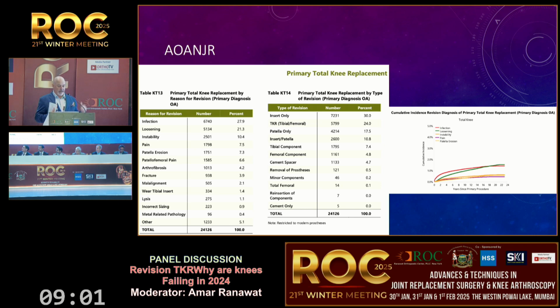Yeah, but there are some very good polys out there, right? And I think Dave made the point yesterday that most of the time when we make changes to our poly, we make mistakes. Right now, the highly cross-linked poly in the hip is fantastic, and it's only getting better. But now we're adding vitamin E, and lots of companies aren't giving you the choice. You just have to use it. So in the hip and in the knee, we'll see if vitamin E really is an added benefit or just an extra cost that we're all bearing. The article is about X3 poly. X3 poly, yeah.